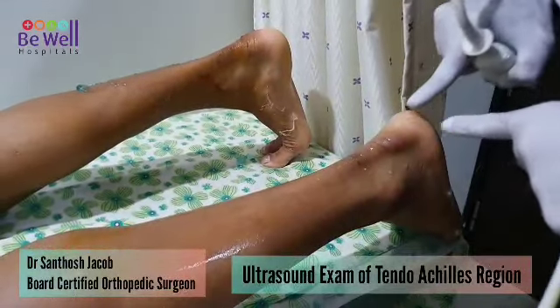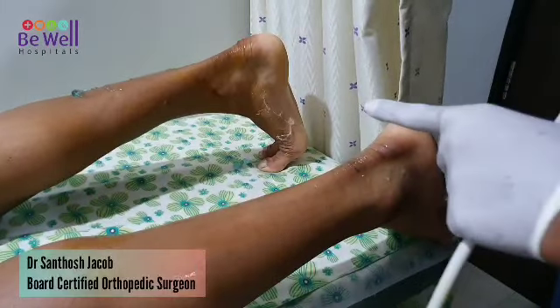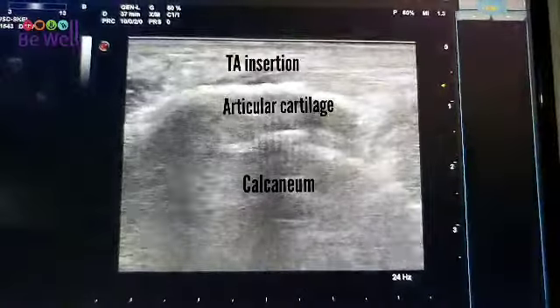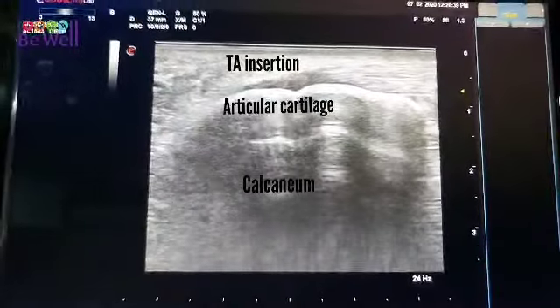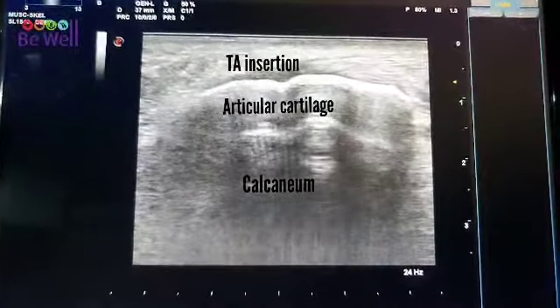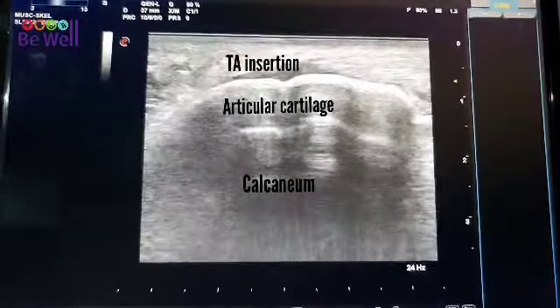You will be seeing the skin from here on top in the ultrasound. Here we are — this is a very clear image where the calcaneum is visualized. The white bright line is the articular cartilage.